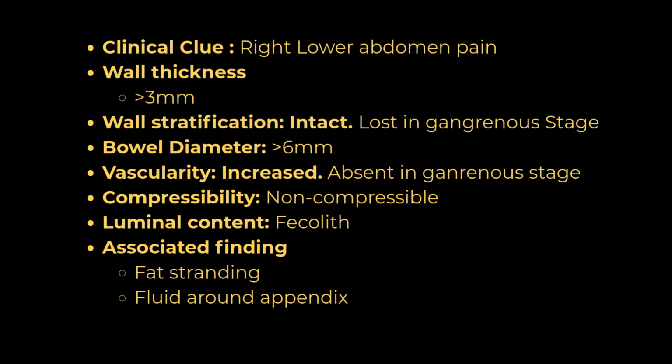Observe the luminal content. Look for fecalith. Compress the appendix with the probe. An inflamed appendix is not compressible. Also, look for secondary signs such as fat stranding and periappendiceal fluid.